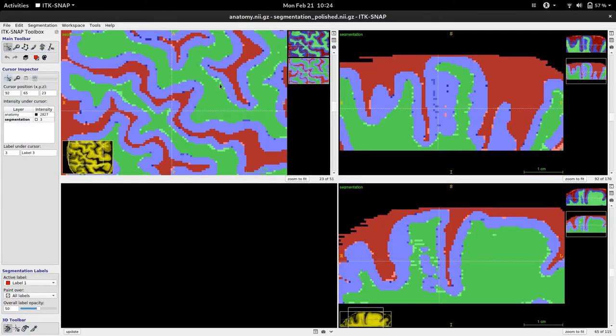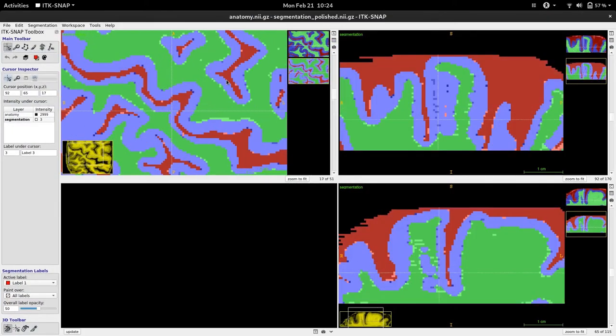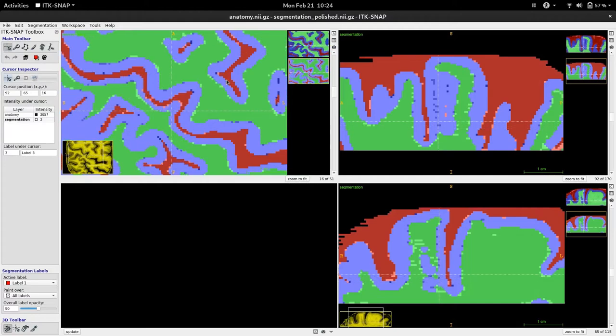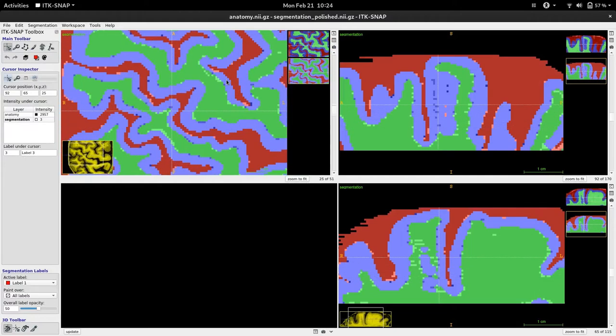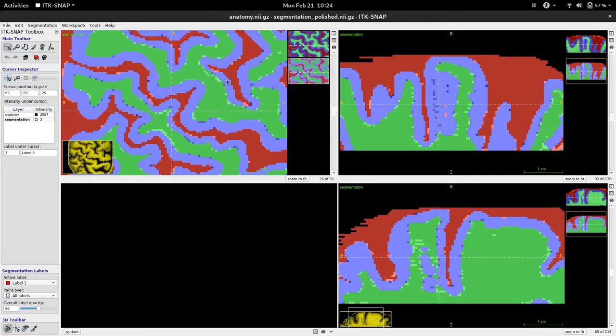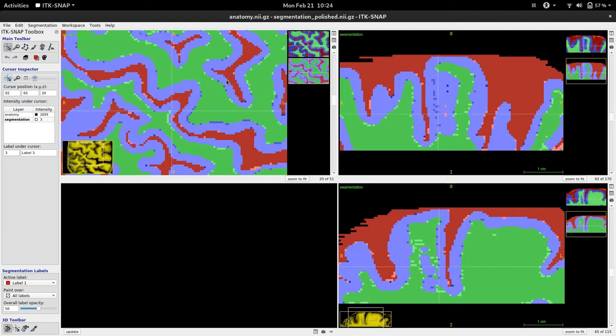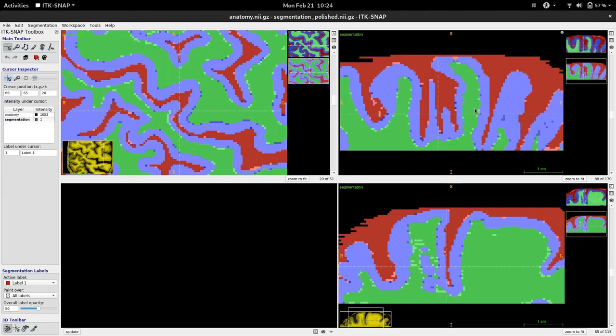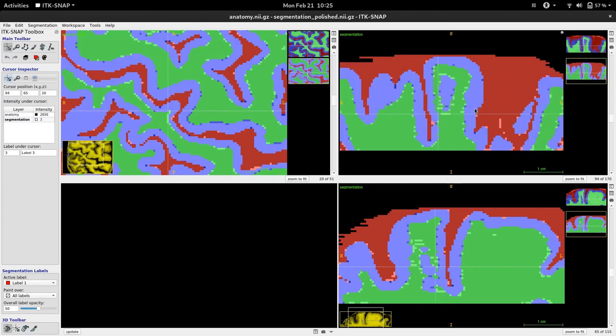So now what you are seeing is that in color our polished white matter, gray matter segmentation and underneath our previous segmentation. In most cases this Python segmentation polish script quickly takes care of the irregular in and out parts of the segmentation and made it much smoother.